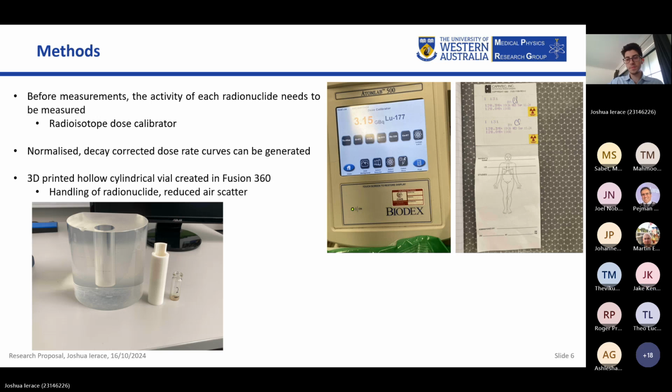Thanks, Mashid. Martin? What you're doing basically, when you're doing the validation, is looking at how accurate the calculations are from the model, and then how the different source models impact that accuracy. You may have mentioned it, but I guess at some point there'll be a tolerance, and within that tolerance you'll say the calculation is valid.